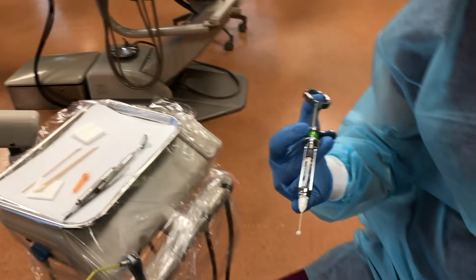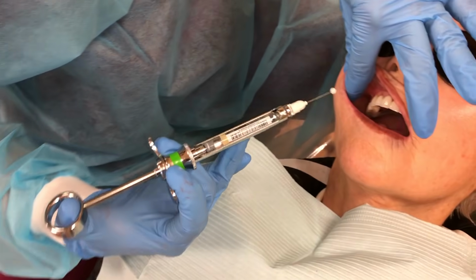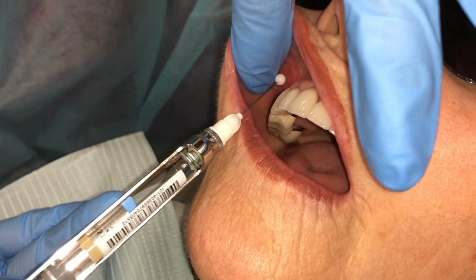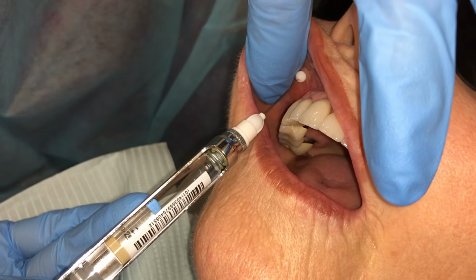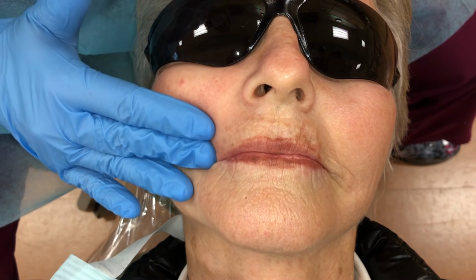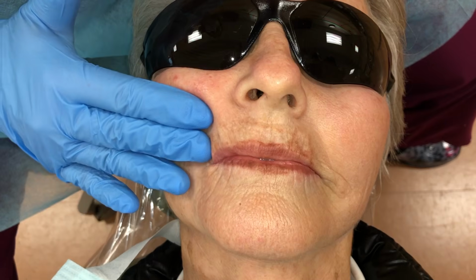Achieve stability. Identify the penetration location above the first premolar and make the syringe parallel to the mid-sagittal plane. Once you have deposited the bolus, you will massage for approximately 1 minute to allow the medication to enter the infraorbital foramen and provide pain management.